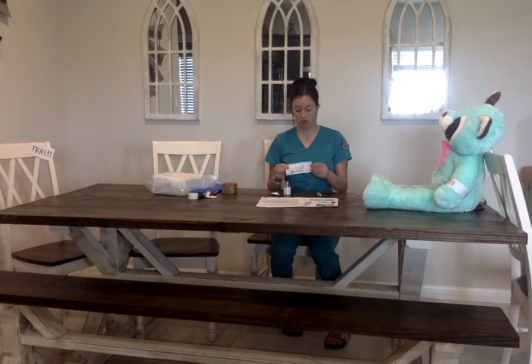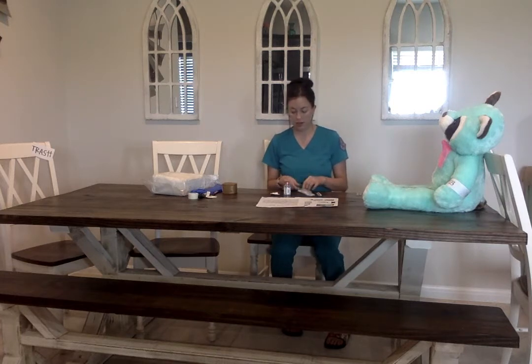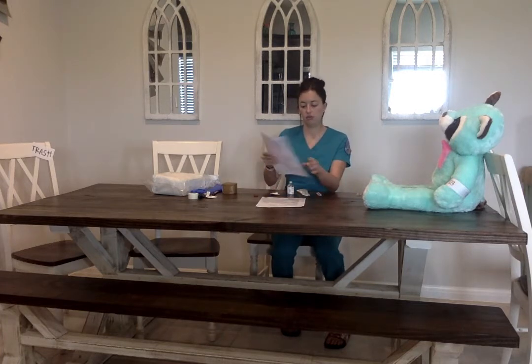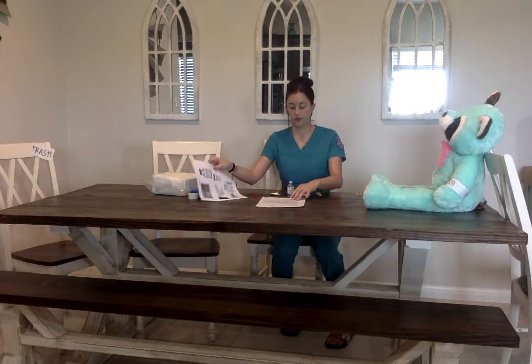I have a 3 milliliter syringe, 22 gauge, 1.5 inch needle that I'm going to be using, but I'm going to start by checking the MAR to the medication, which is great.